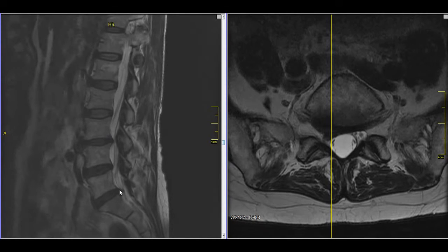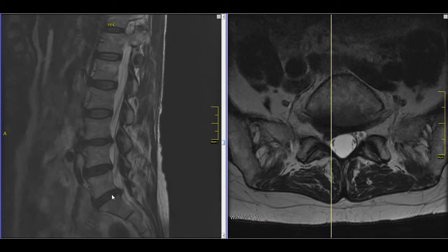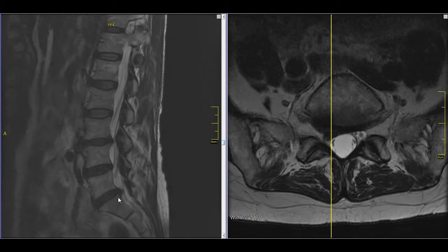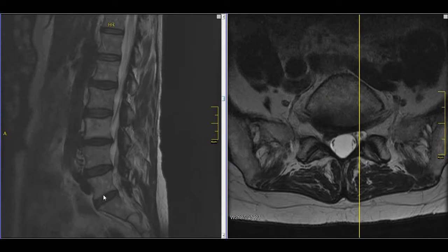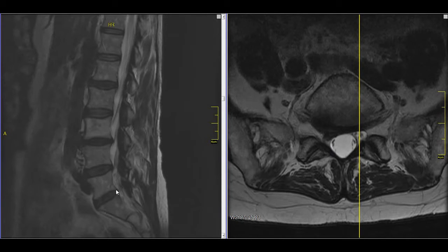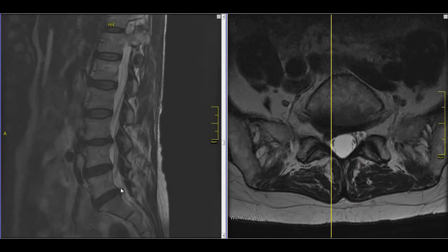This is what a herniated disc is. The disc is not a solid structure — it has a ring of fibrous material and then an inner softer material made out of cartilage. This is often described as crab meat; it has that consistency, it's not liquid but it's fairly firm. It's a little extruded piece of cartilage that has left the disc space and is lying in the nerve space here under the nerve. If we go to the other side, we can see that's not the case there — on the left side there's nothing, but if we scroll over to the other side, that's where we see that thing.